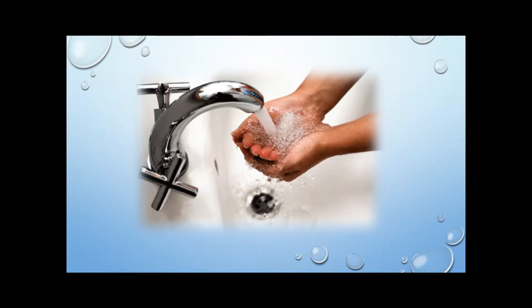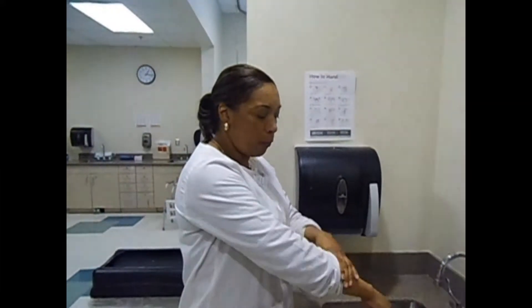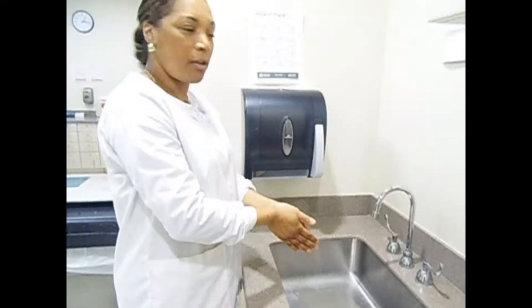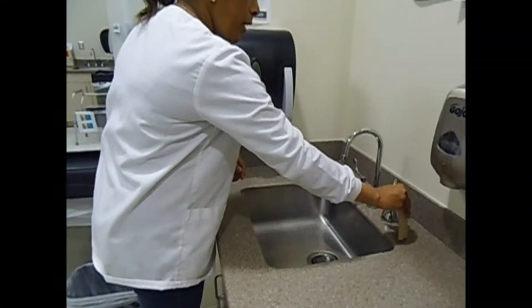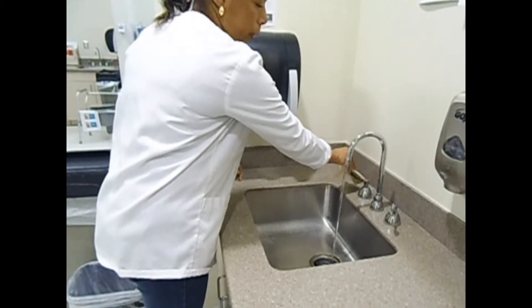Let's watch a video on proper hand hygiene. Keep your clothing away from the sink and do not touch inside or outside of the sink. The first thing we're going to do is pull up our sleeves and remove all jewelry. The next thing is to turn on the water — grab some paper towels and turn on cold water first, then warm water.